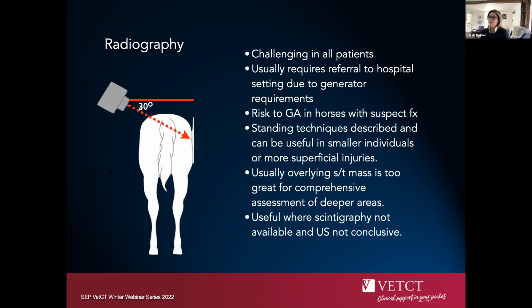The risk of GA radiography is high, particularly when we're thinking about horses with suspect fractures, and so it's gone out of fashion quite significantly.